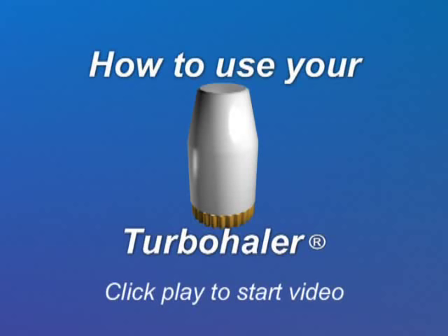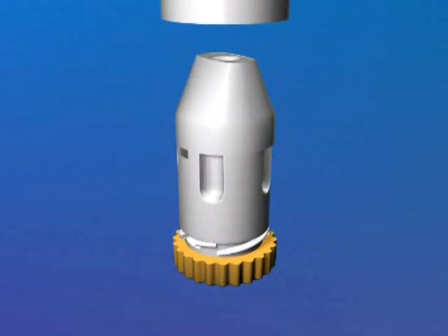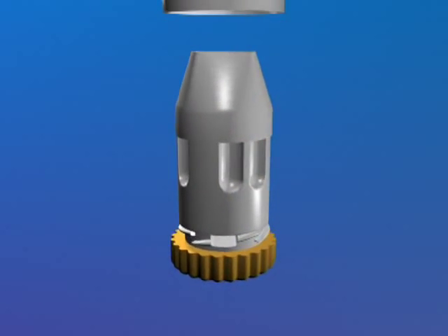This short video will show you the right way to use your turbohaler. The turbohaler is a specially designed inhaler device that delivers a measured dose of medicine straight to your lungs.